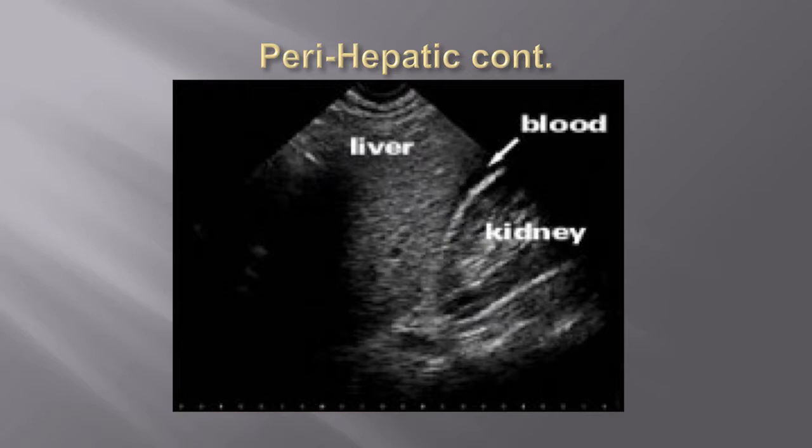Black, hypoechoic. And let's say, for example, this person got injured about 15 hours ago, okay? Or let's just say 24 hours, right? They went home, 24 hours later, they show up in the emergency department complaining of abdominal pain, and you do a FAST exam, and let's say you get this image, and instead of black, you have this weird little fuzzy image in here. Would that be a positive FAST exam? Yeah, it's clotted blood. Remember we said when blood sits around and clots, it starts to almost look like tissue. It doesn't quite look like this, nor does it look like this, but there's definitely something between both spaces here, and it's probably clotted blood. All right, and if they're not hypotensive, you can send them off and get a CAT scan or whatever, but if they're hypotensive, you know you have a positive FAST exam. So that's the first spot that one's gonna look.